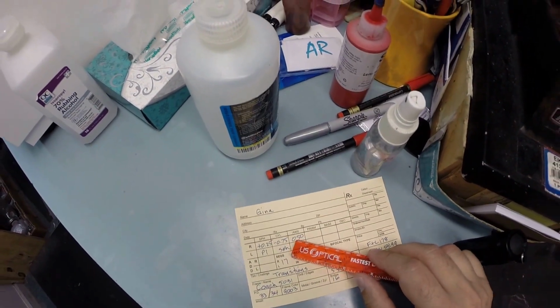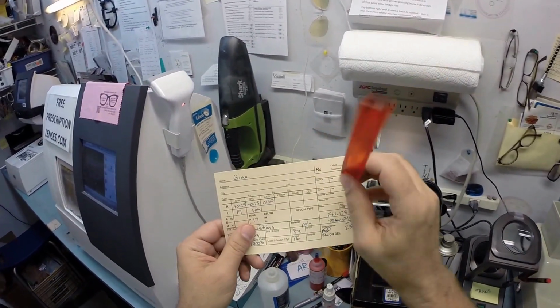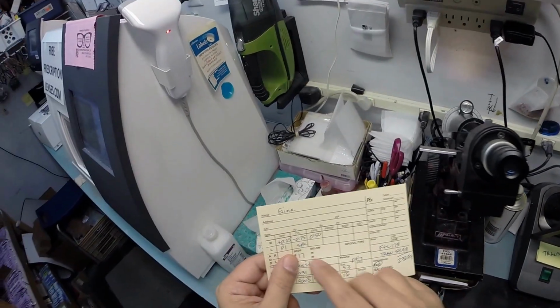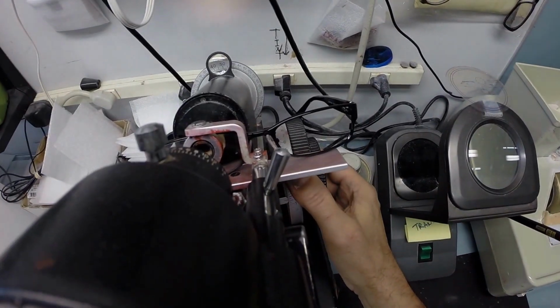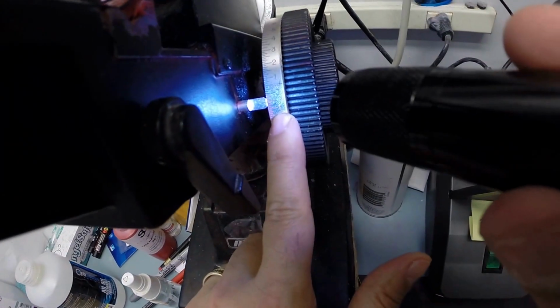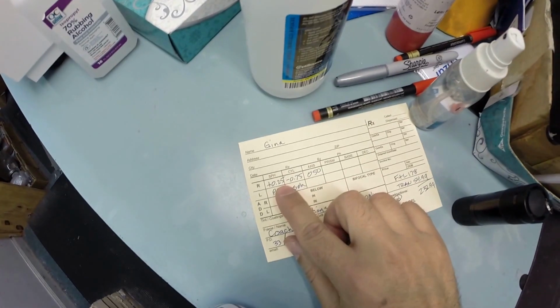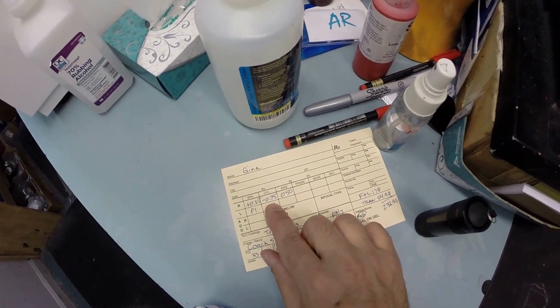We're going to turn that knob to 50, a straight line. Over here at this end is 0, 90 in the center, 180 over here. We're going to turn that knob to about 50, just past the 45 degree. And let's go ahead and check that. We were at plus a quarter. We're going to do minus 75. Check that, make sure that comes out okay. And we're at minus 50, exactly halfway between 0 and 1 in the red. We went from the black, this is like the roulette table, to the red. Imagine if you had 25 cents and you had let someone borrow 75 cents, which I don't know you can have if you only have a quarter. You would be 50 cents in the red. That's where you're at, 50 in the red.